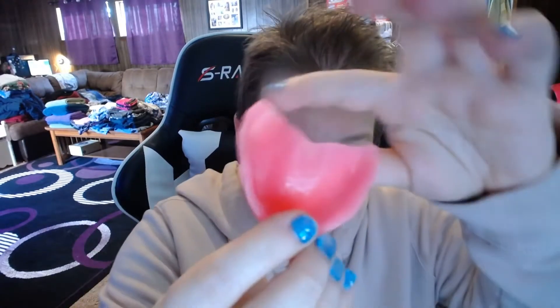So I'm going to take out my dentures. This is the upper. Jamie has cut some off the back for me because he knows my gag reflex is horrifying. And that actually fits really well.